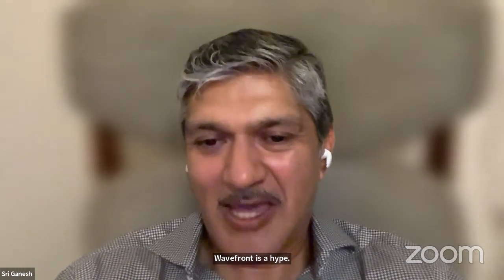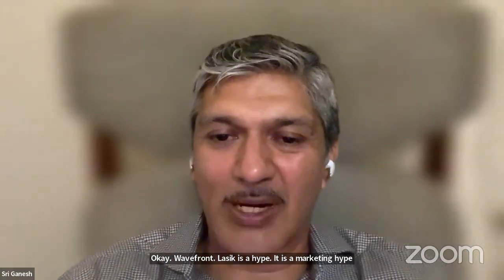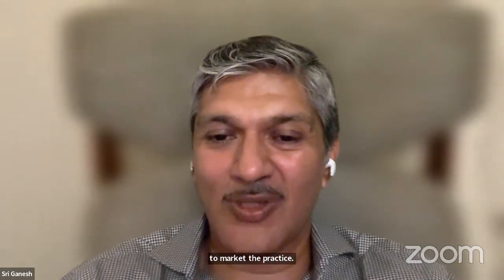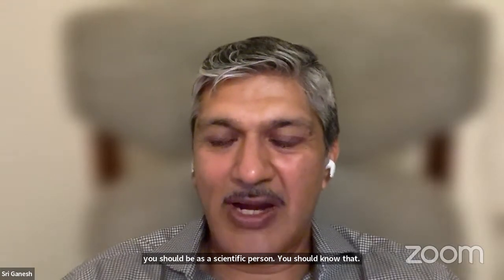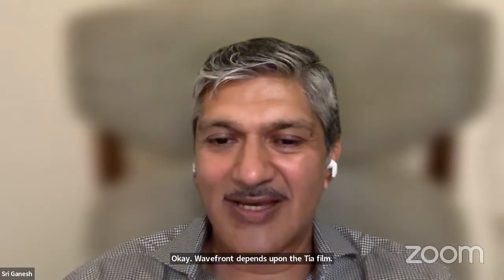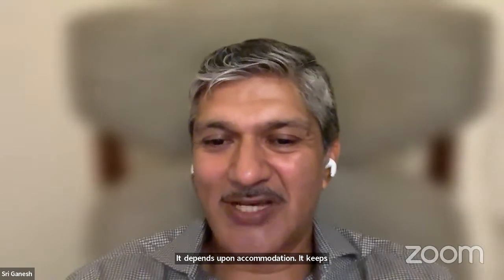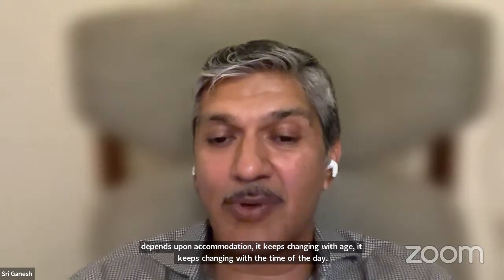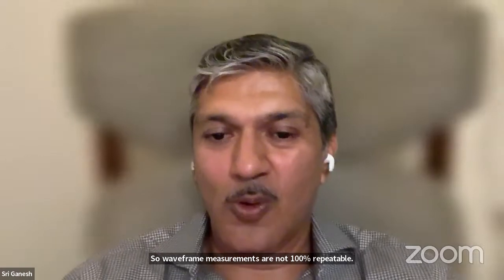Wavefront LASIK is a hype. It is a marketing hype. It is something good that you can market if you want to market the practice. But as a scientific person, you should know that wavefront itself is very dynamic. Wavefront depends upon the tear film. It depends upon the pupil size. It depends upon accommodation. It keeps changing with age. It keeps changing with the time of the day. So wavefront measurements are not 100% repeatable. This is something that you should know.